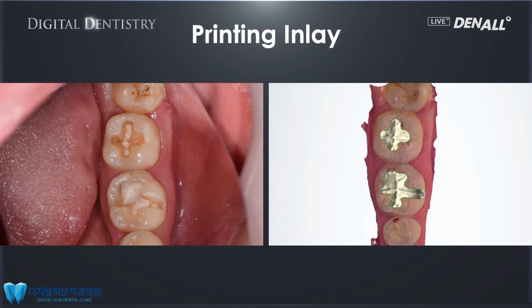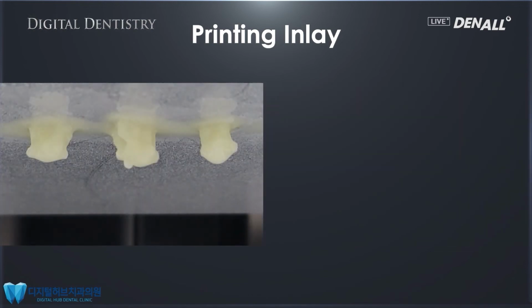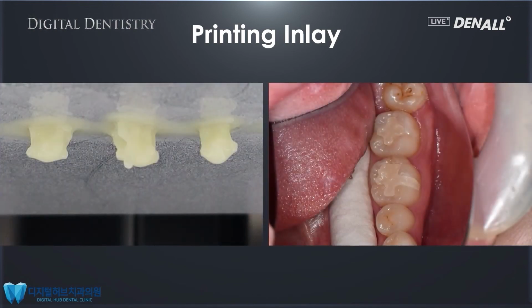Another case, on the posterior, two were prepped and scanned and designed, and using the 3D printer, inlays were printed, and this time the supports were all removed before it was adapted to the patient, and the inlays were fit into the mouth.